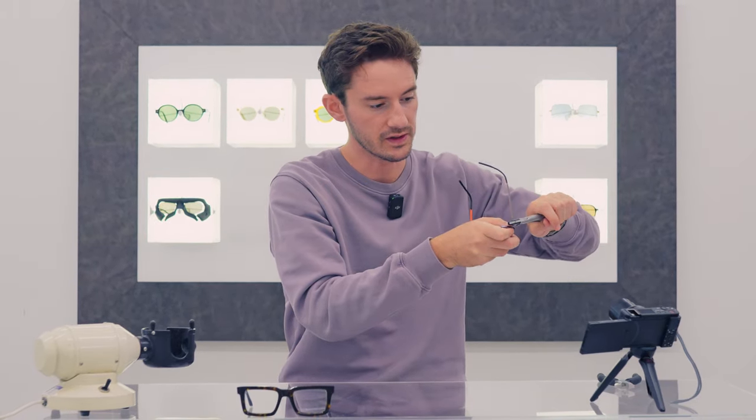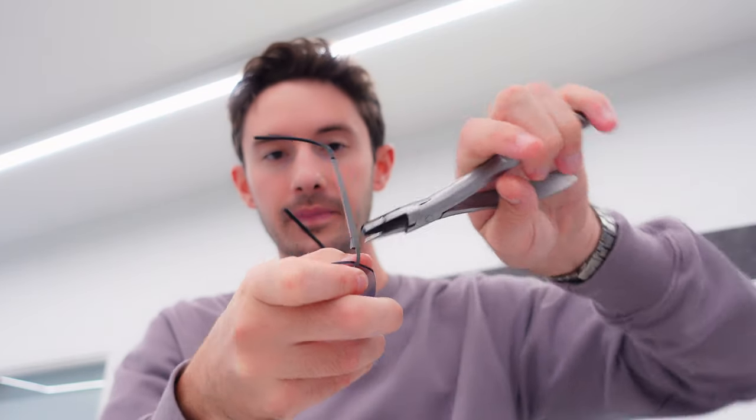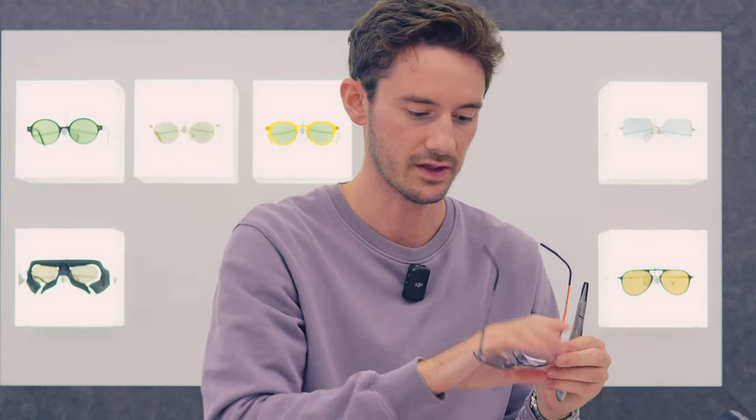If we want to increase the pantoscopic tilt, what we're going to do is bring both temples down by the same amount. That is going to introduce more pantoscopic tilt. So as I put these glasses on now, you can see that these are now angled in towards my face.